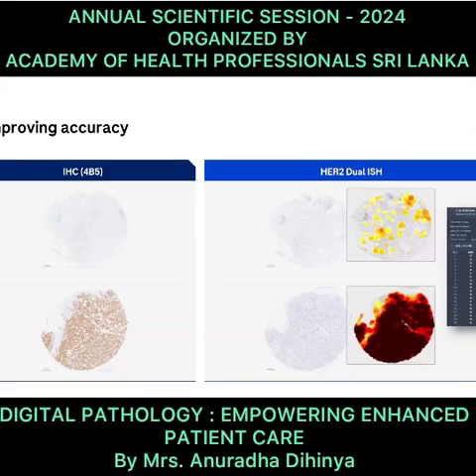So as I was saying about the HER2 dual ISH, where the score is around 1.8, in the topmost case you are able to see there are not many orangish and maroonish areas. There are many yellowish areas, so it means that it is a low amplified case. The heat map here helps the pathologist to focus on those areas, and they can generate the score out of it.